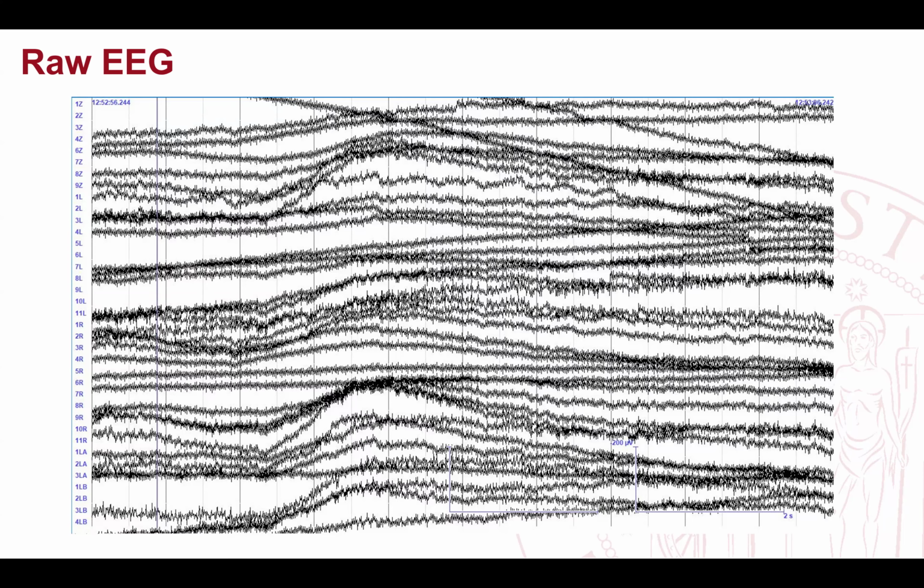The raw EEG signal on its own, with respect to other types of signals, such as, if you ever worked with EMG or speech production, or even the signal produced by a gyroscope, those are immediately clear, even if you don't do anything.